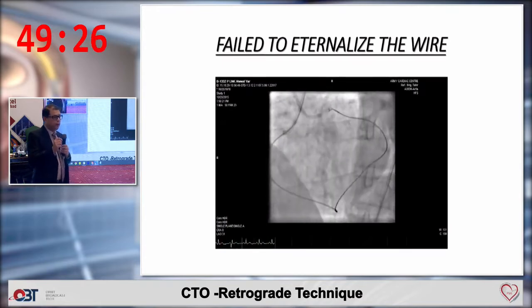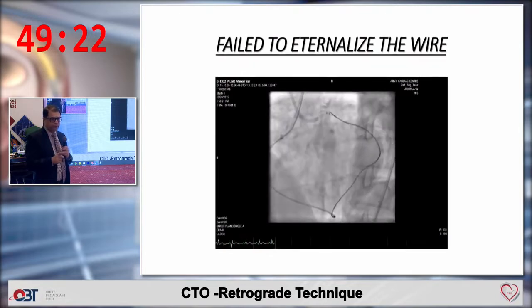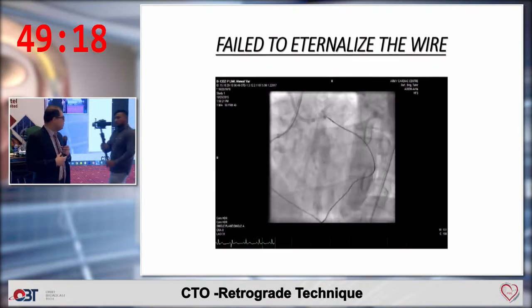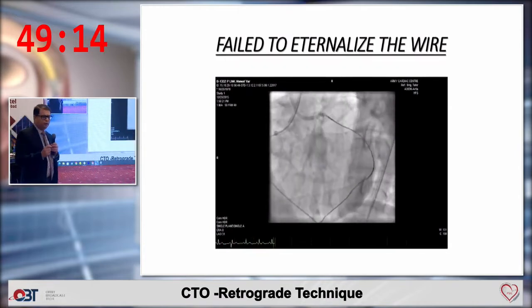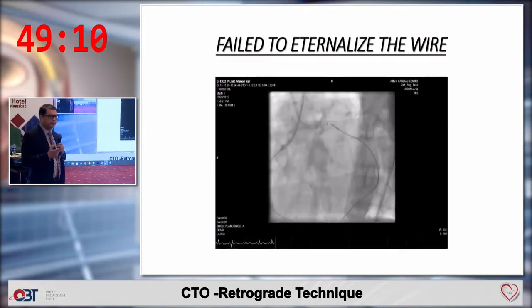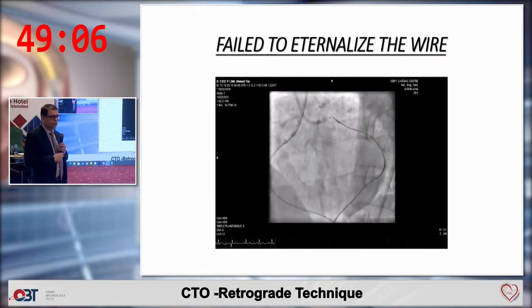And when you are doing a retrograde, you should go for septal collaterals first because they are safer as compared to the epicardial collaterals. But an epicardial collateral like this is a very large collateral, so you can do it safely, but I agree that sometimes you can have more complications with retrograde PCI.